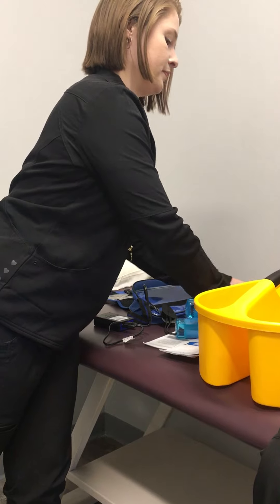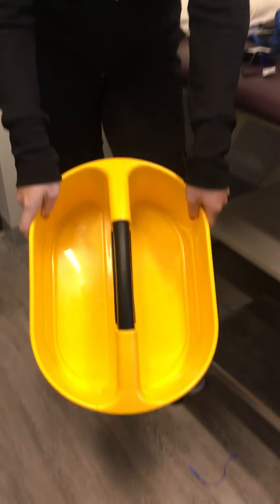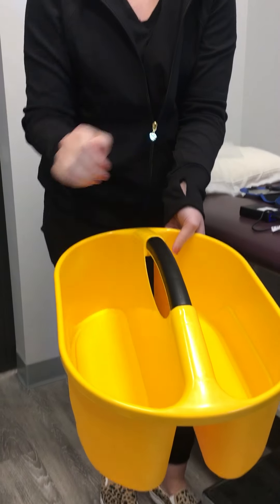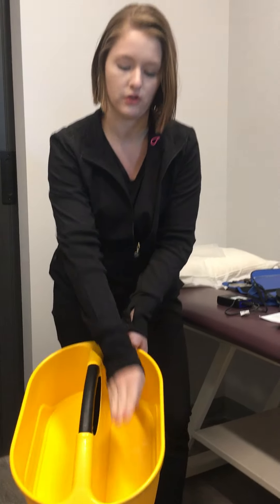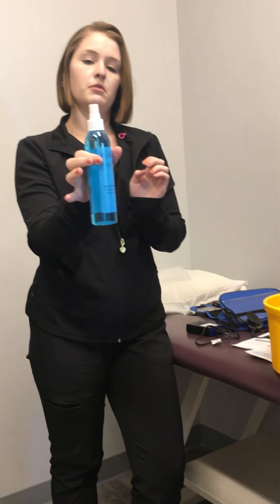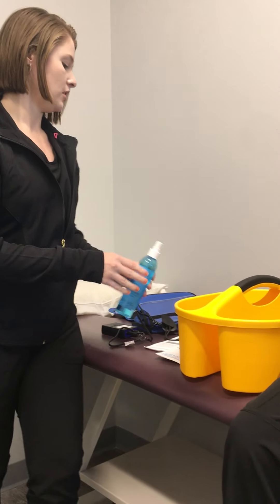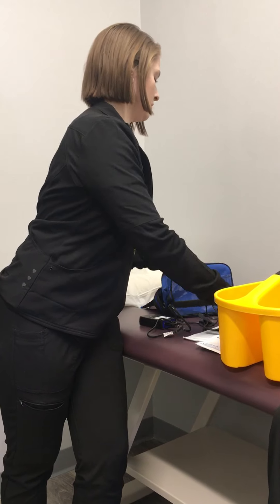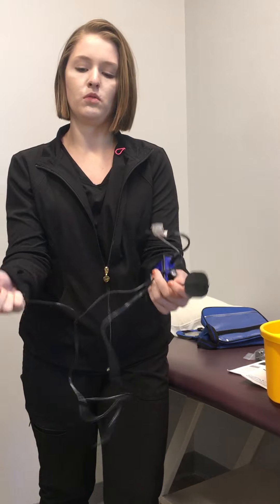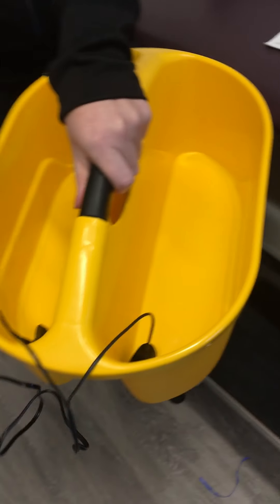Then you're going to take your yellow bucket — there are two compartments. You're going to fill each side up with water until it will touch your ankle when you put one foot in each side. After, you'll unscrew the bottle and measure out one teaspoon of liquid that will go in each side, and then you will take one pad and place it in each side of the bucket.